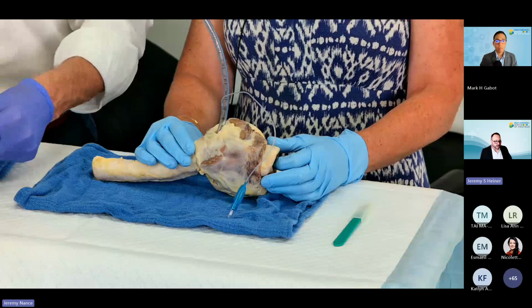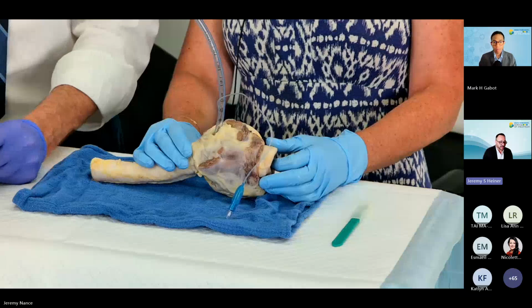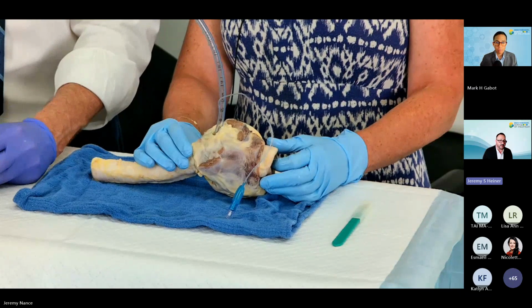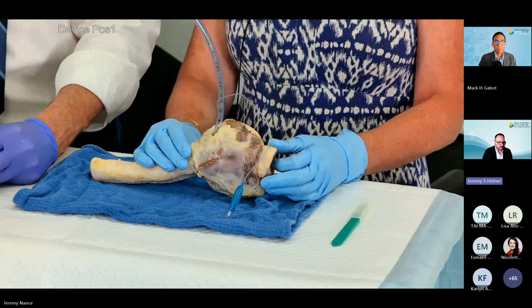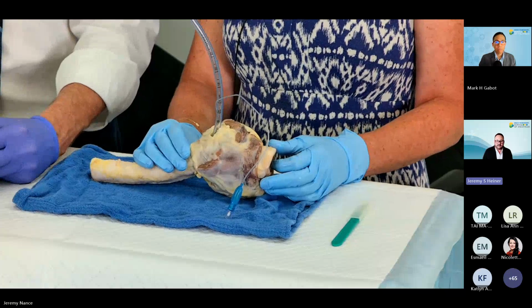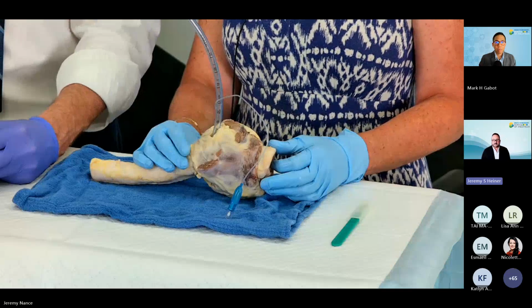Now, if you read the emergency medicine literature, there's plenty of literature on cricothyrotomy for emergency medicine physicians, and they do advocate for that initial vertical incision because a lot of times they are doing this in very high stress, emergency situations, and once you do that vertical incision, it allows you to feel that cricothyroid membrane a lot better.